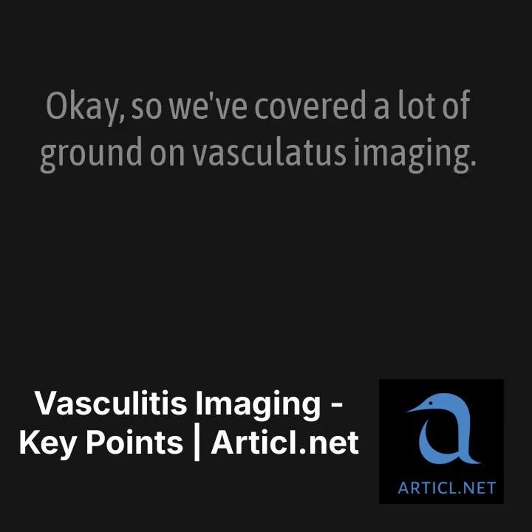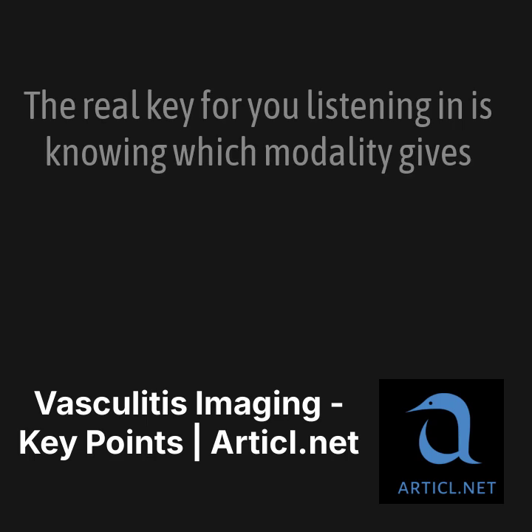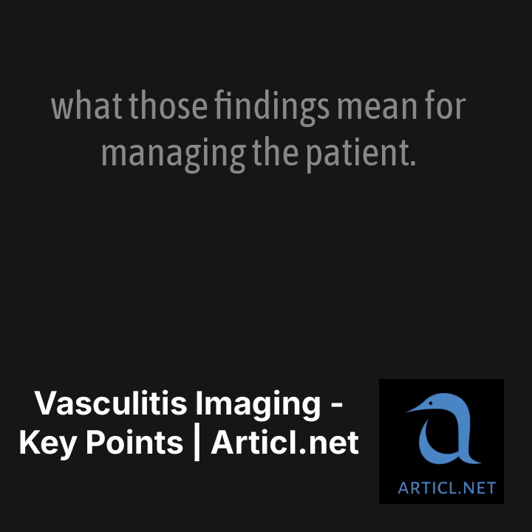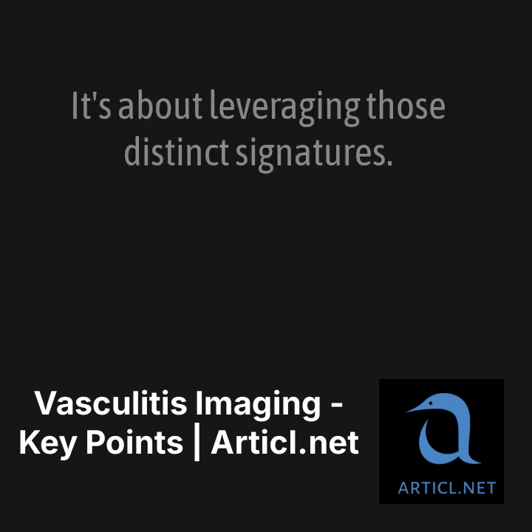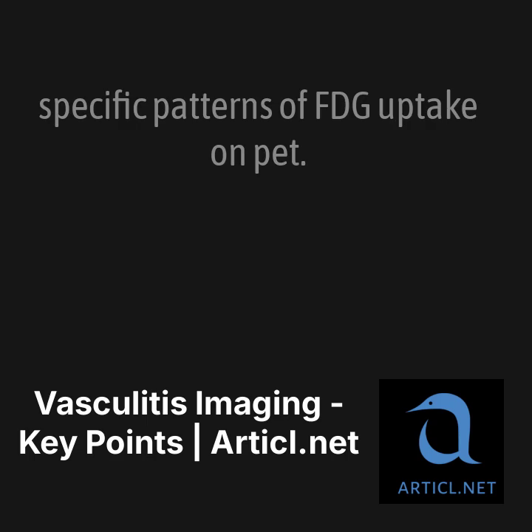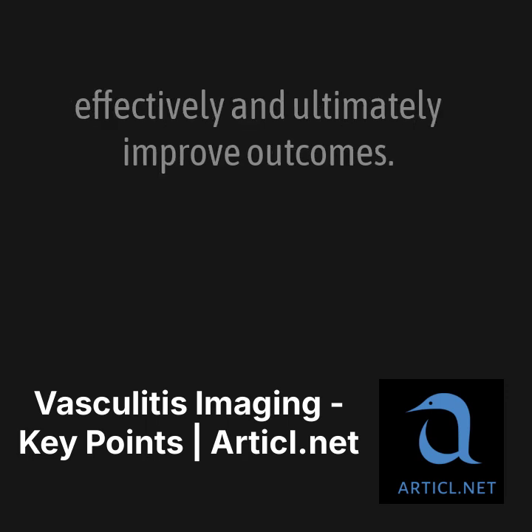Okay, so we've covered a lot of ground on vasculitis imaging. The real key for you listening in is knowing which modality gives the best insights for different vasculitis types and, crucially, what those findings mean for managing the patient. Absolutely. It's about leveraging those distinct signatures: that halo sign on ultrasound, those PAN microaneurysms on CT, specific patterns of FDG uptake on PET. Recognizing these helps us guide interventions much more effectively and ultimately improve outcomes.